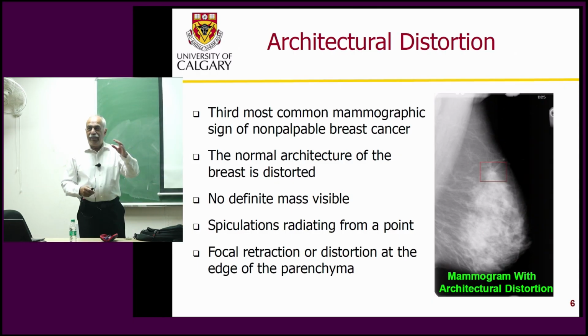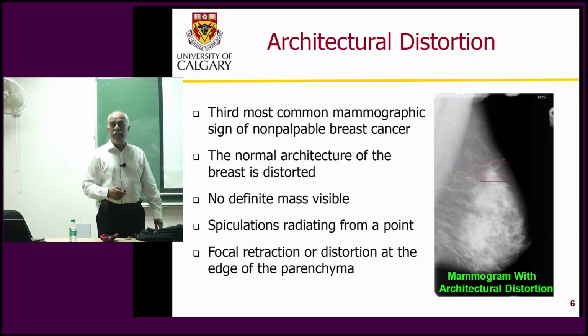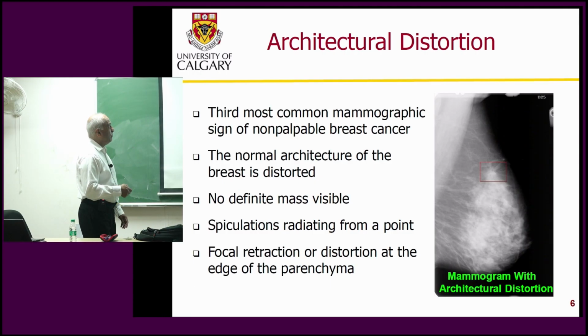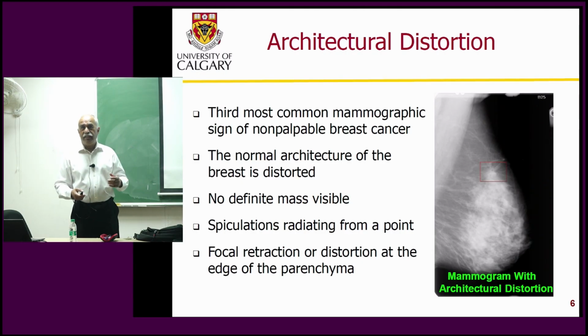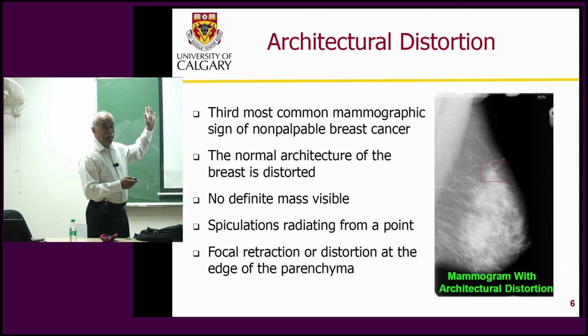So eventually we came to that stage with some understanding as to what it is through presentations by radiologists, pathologists, and so on. They showed slides, they showed mammograms, and some articles were written by the medical specialists. Dr. Desautels, our colleague from radiology and the screening program, came up with some definitions and patterns that we could understand and develop algorithms to detect. Otherwise, the definition of architectural distortion is very strange. As I said earlier, it says the architecture of the normal breast is distorted. That doesn't help us. That is what the name says anyway.